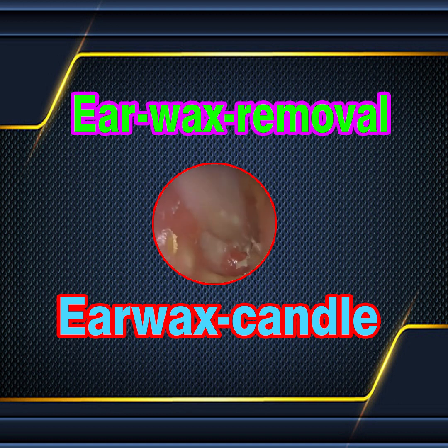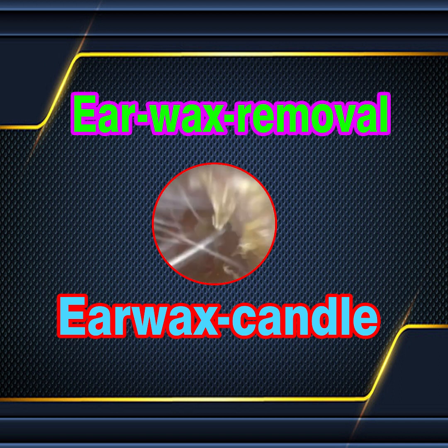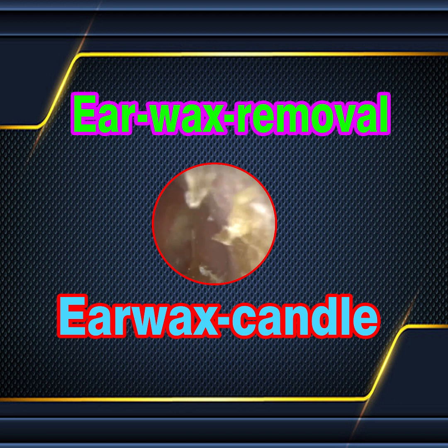Just, as I said, bend the tip of the fine end to get access. Otherwise, I'd make contact with the front part of the ear canal. You can see I'm pretty close to it, even with the tip of the fine end being angled. But I want to avoid that because it is very sensitive. And I know firsthand because I've had that part of my ear poked before and it was not very nice and not very comfortable. So just got a piece out there. I'm just going to go back in to extract the rest.